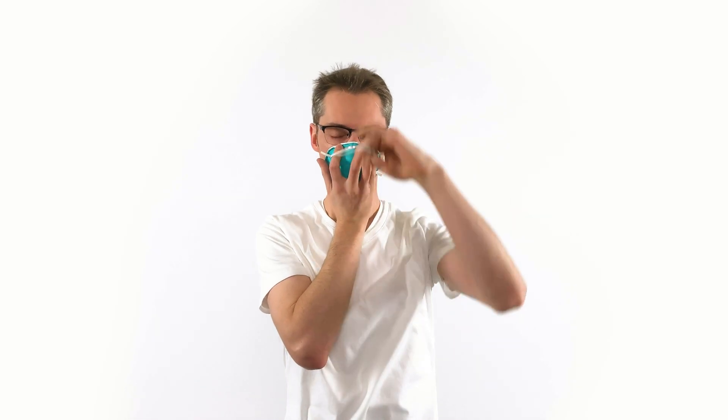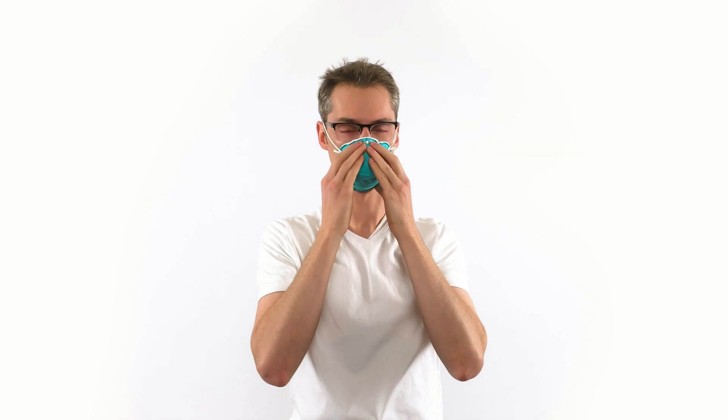The top strap goes on the crown of your head. Remember, this order is important — bottom strap always first. Mold the nose piece to fit your nose.